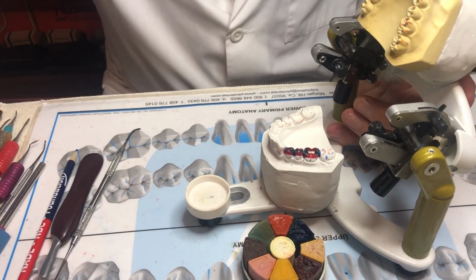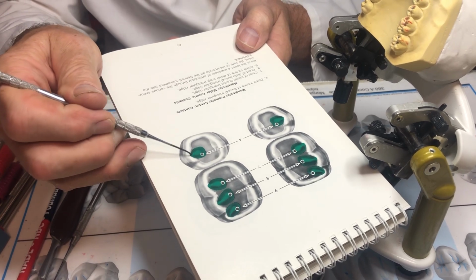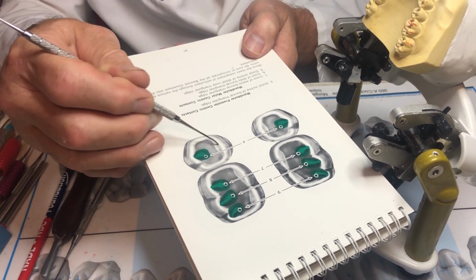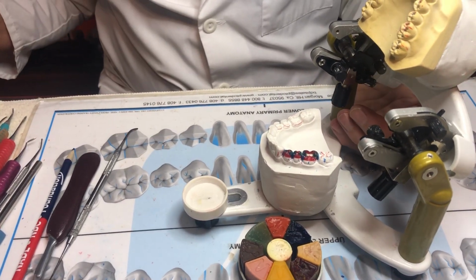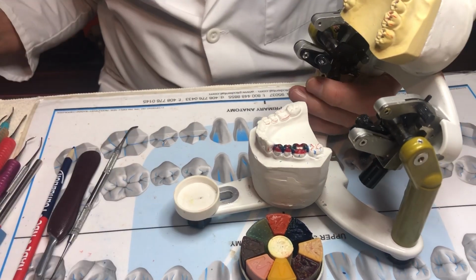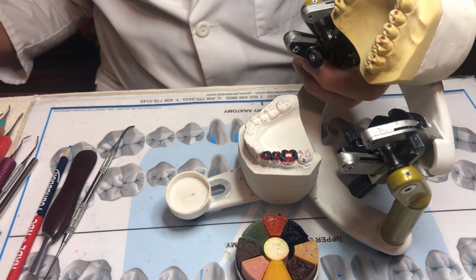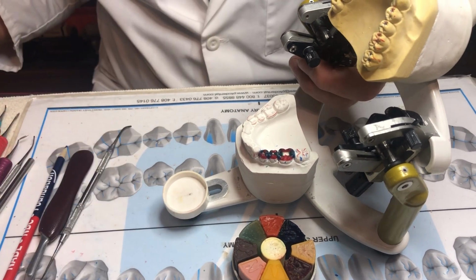So first thing I'm going to establish, let's try an easy one. Let's go with the triangular ridge, buccal cusp. I'm going to start down in the center. I'll establish that, then here. Then I jump to the lingual, and I finish that. And we're going to go from tooth to tooth to tooth. I'll do a few of them. I don't need to do all of them in the video, but I'll do a few just to get things started. And there's not that much at this point. So if you can see, I'm adding a very small amount. Remember, the whole idea is not to have to change anything, not to cut anything away.